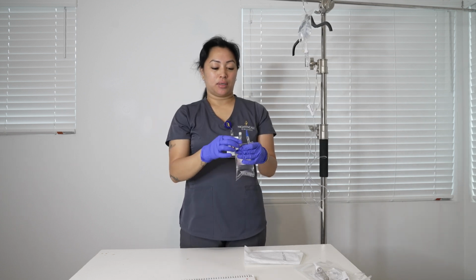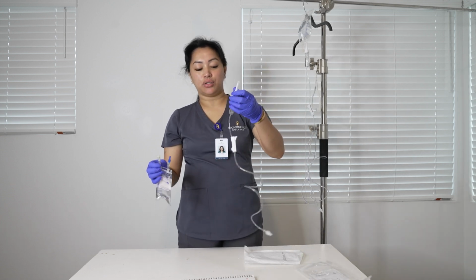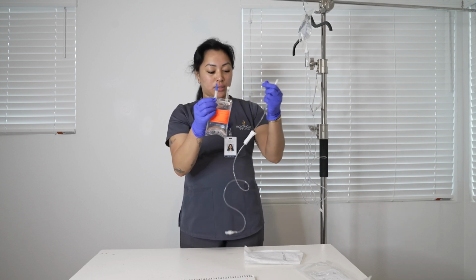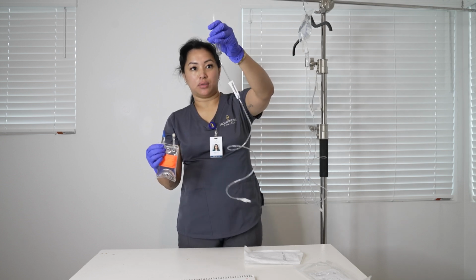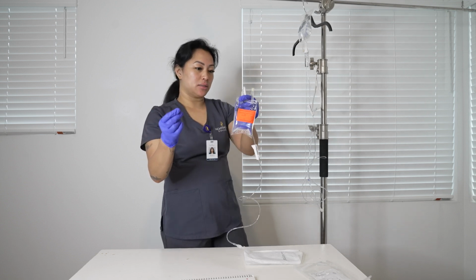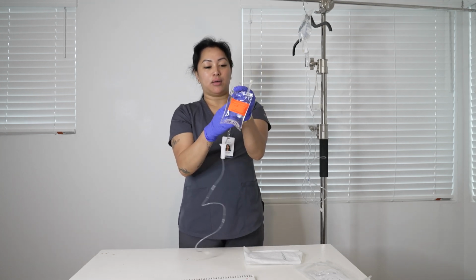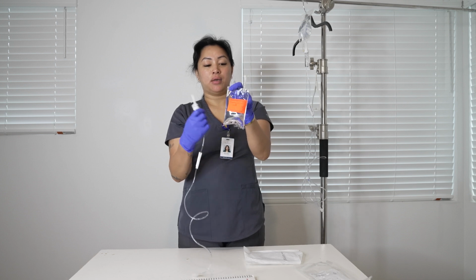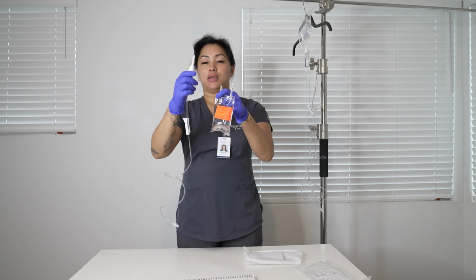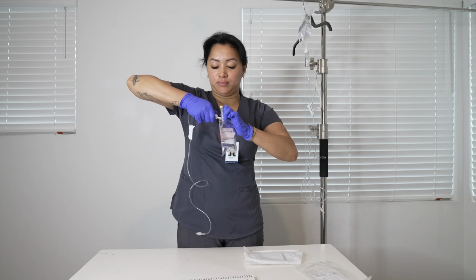So now I am going to attach the secondary tubing into the amoxicillin. So the roller clamp is all the way down. We always have to make sure to prevent the medication from leaking. So now I have taken off the cap of the amoxicillin, and then now I am going to take off the cap of the spike. Alrighty, so now I'm going to insert the spike into the medication.